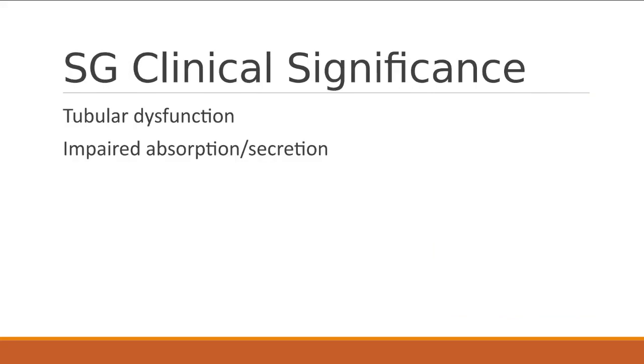I'm not going to talk a lot about specific gravity because we've talked about specific gravity a lot. But I do want you to know just the clinical significance of it. The principle is going to be based on the change in pKa of a polyelectrolyte in an alkaline medium. So that would be your principle of it. You don't really need to know it for your exam, but everything has a principle with all of these reagent strips. And a reagent strip does have specific gravity on it. They're measured in 0.005 intervals, so it's a really small number. Specific gravity doesn't go up very high.